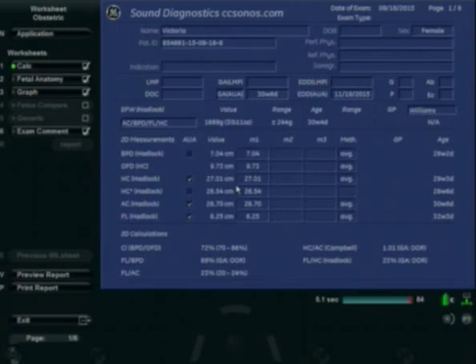This one's not any different than that. As long as she's not like Mason, I'm okay. Because Mason was huge. What this is suggesting is that this baby is the size of an average 30-week, 6-day baby as opposed to your 28. Okay. So the baby is ahead of schedule as far as size goes. You might have her early. Good. She's on track. There you go. I want her out by Thanksgiving.